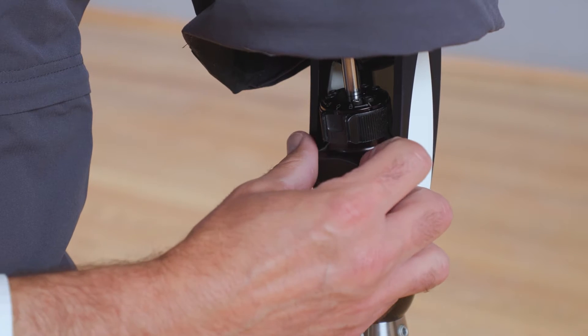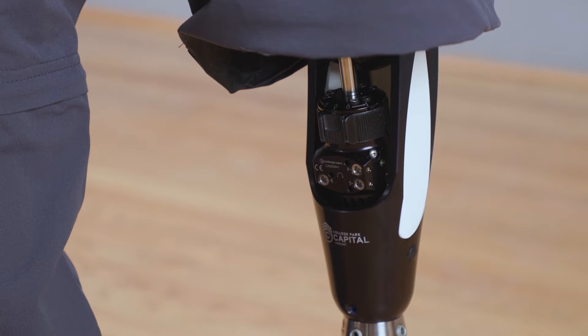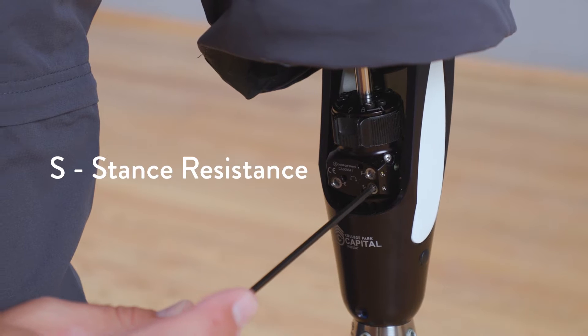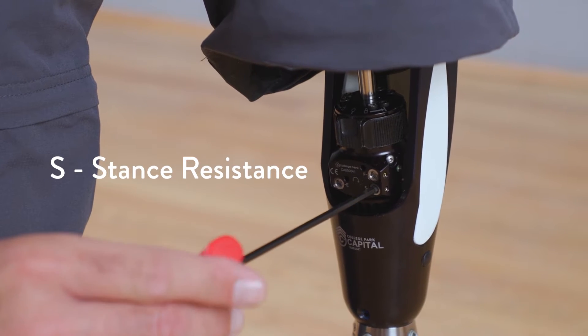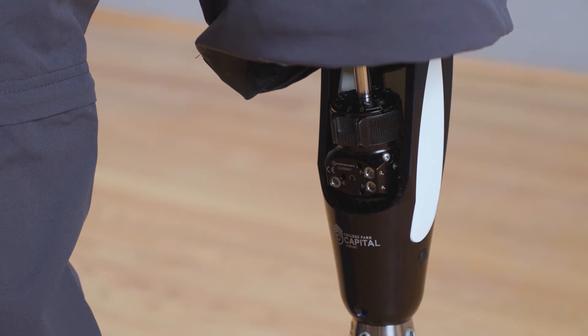To access the hydraulic adjustments of the Capital Knee, you must first remove the adjustment cover. There are three adjustments that control the hydraulic characteristics of the Capital in stance and swing. S is for stance resistance — this adjusts the hydraulic resistance to flexion in stance phase of gait. This can be changed to optimize stance flexion, stand-to-sit resistance, and stair or ramp descent functions.